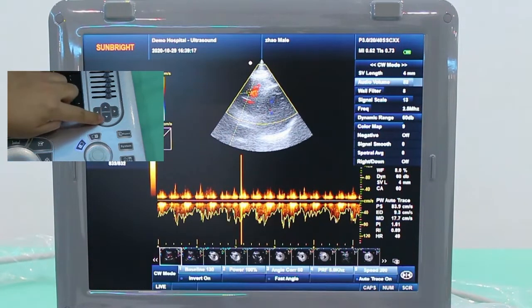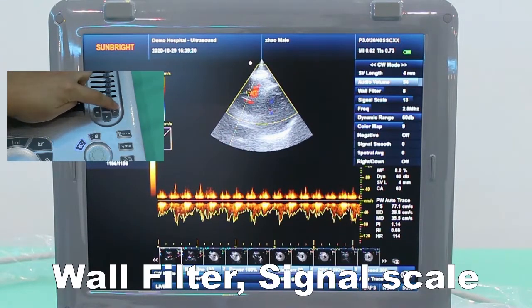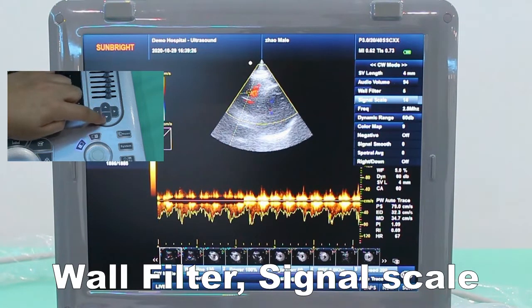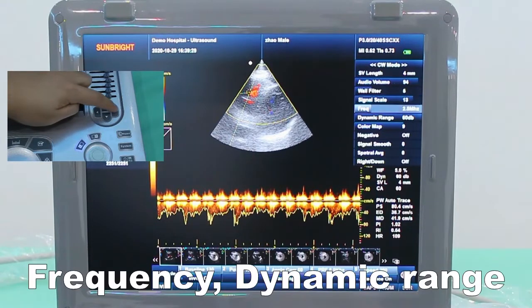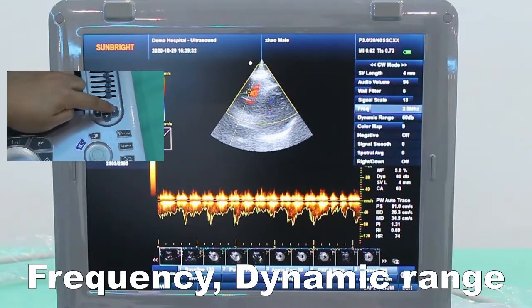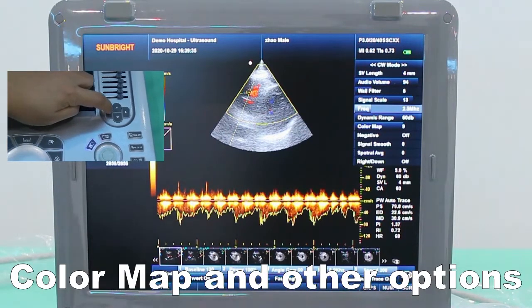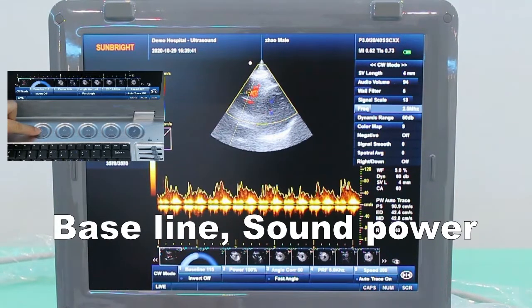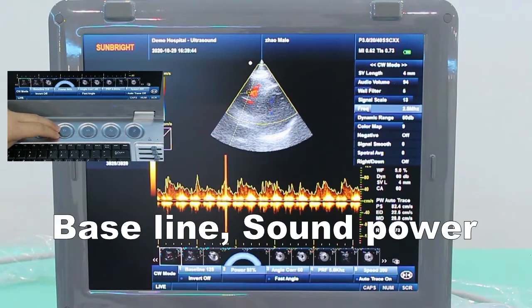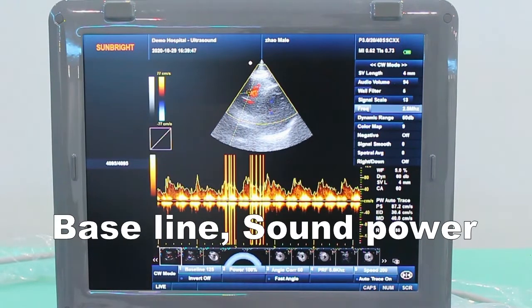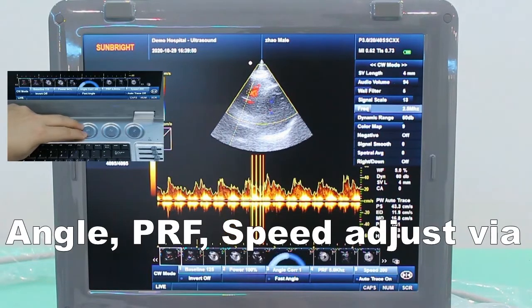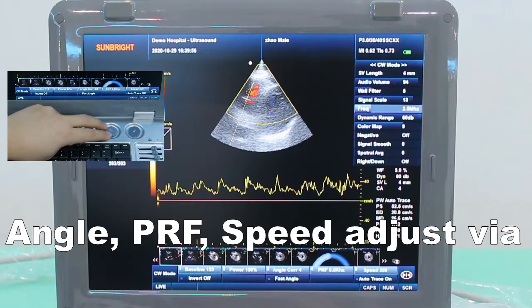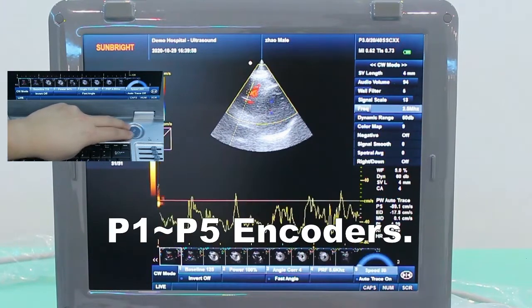CW function controls include: Audio volume, Wall filter, Signal scale, Frequency, Dynamic range, Color map, submenu options, Baseline, Sound power, Angle correction, PRF, and Speed. Adjust these settings using P1 to P5 or the encoder.